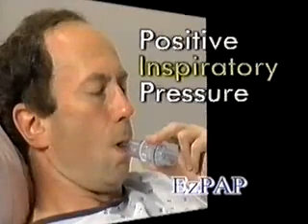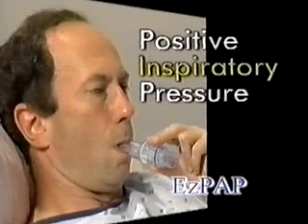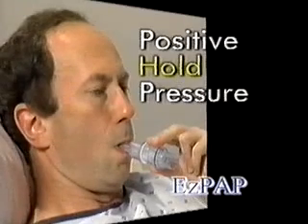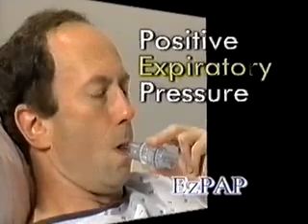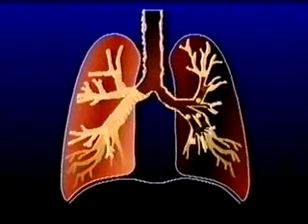With EzPAP, the patient receives a positive pressure inspiratory assist when inhaling, their breath hold is positive pressure, and there's a positive expiratory pressure, PEP, on exhalation. The goal of using EzPAP is to assist the patient in opening the airways in their lungs.